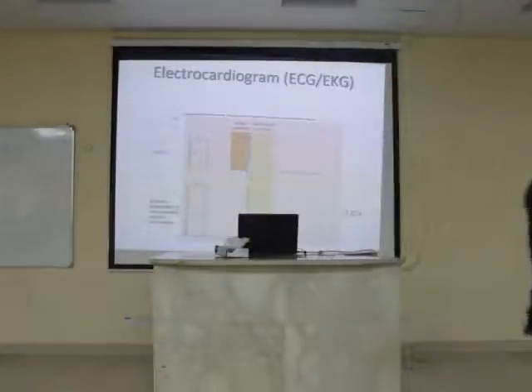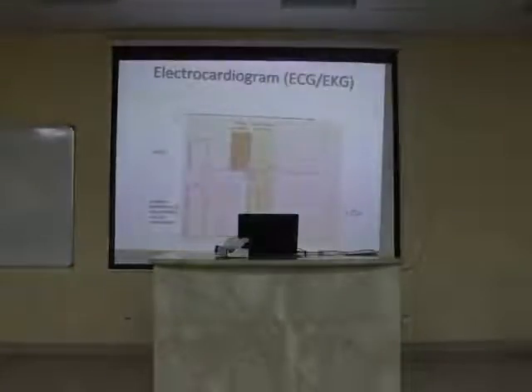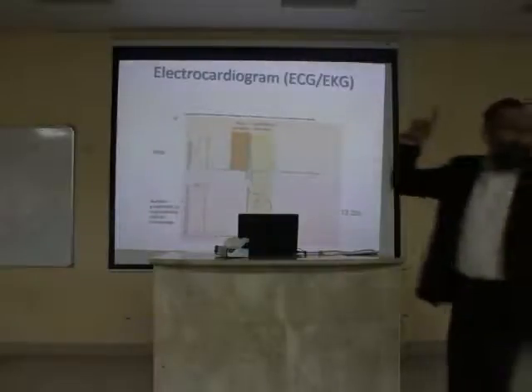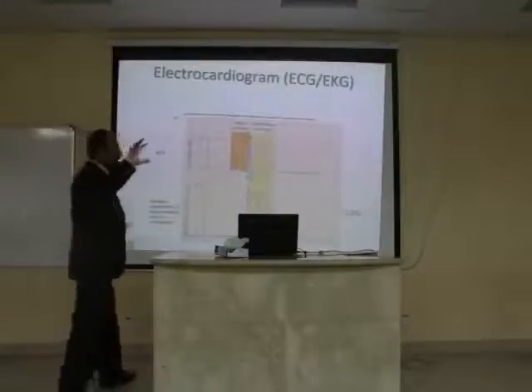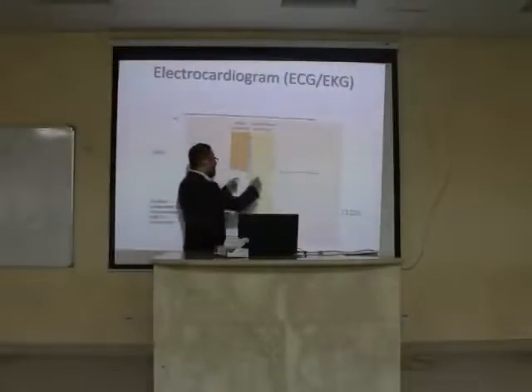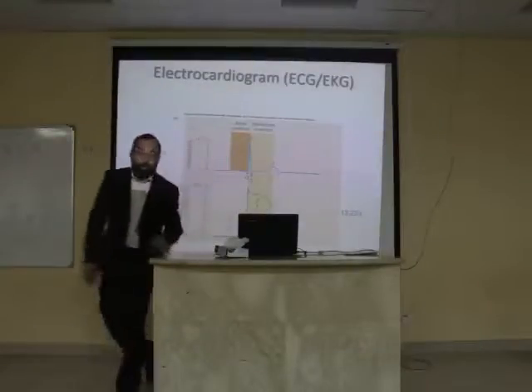In many diseases, many toxicities, many disturbances, you will find a change. Sometimes it becomes shorter, sometimes it becomes longer. You will see, inshallah. But remember, what does it show? What does it mean? You are affecting the ventricle or the ventricular phenomena by changing this QT interval. Okay? Yes.